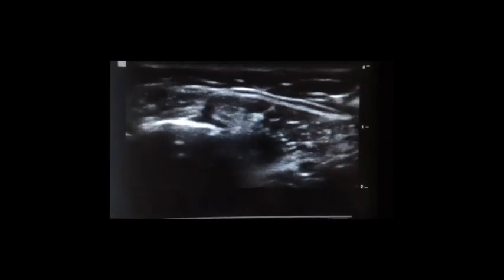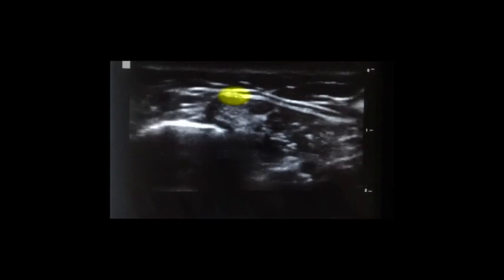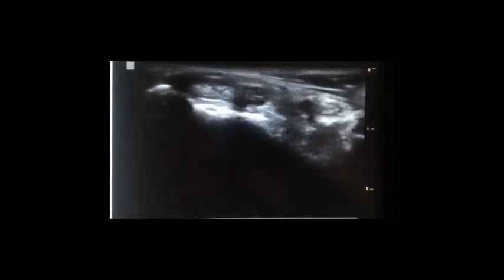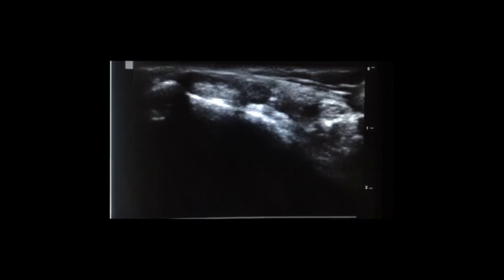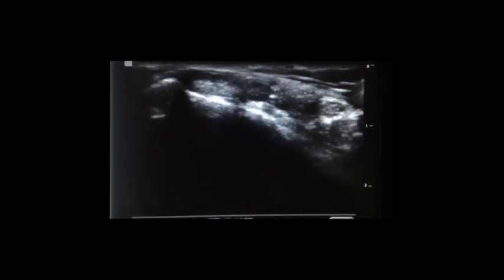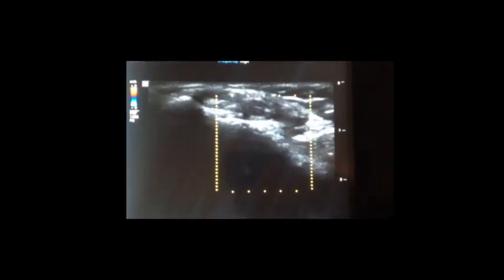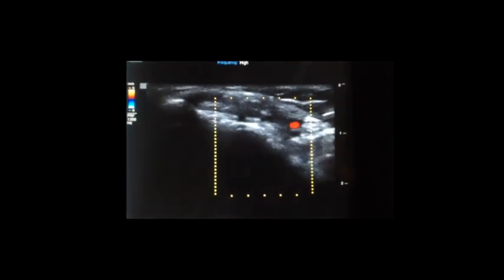With the patient and probe positioned, you'll see these structures just like this — with the posterior tibial tendon here, flexor digitorum longus here, artery, and flexor hallucis longus here. Note that you will get some anisotropy, so wag your probe and try to get rid of that. You can also turn on color to visualize the artery.